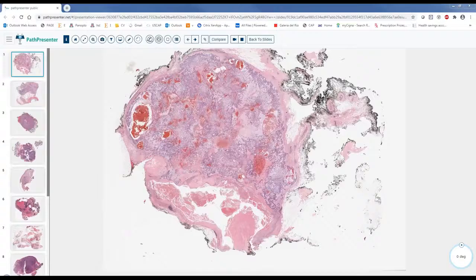All right, so we'll start with the first case. I guess you guys by now, just by looking at it, hopefully you will know what's going on. Okay, let's start with someone who would like to discuss it. Dr. Rabia, can we start with you?